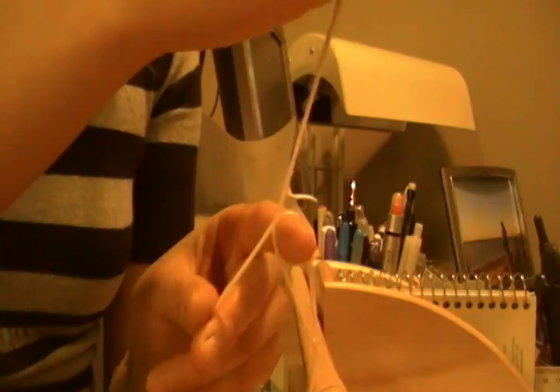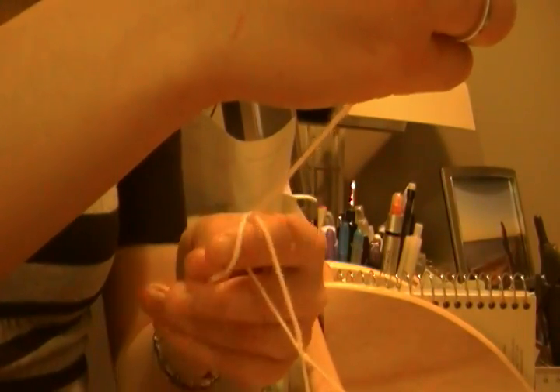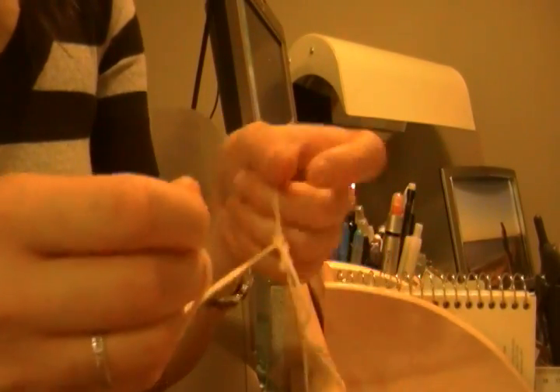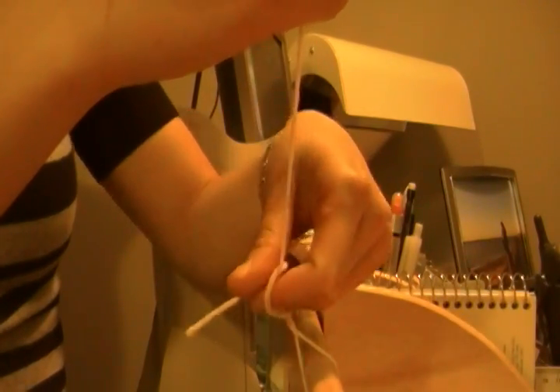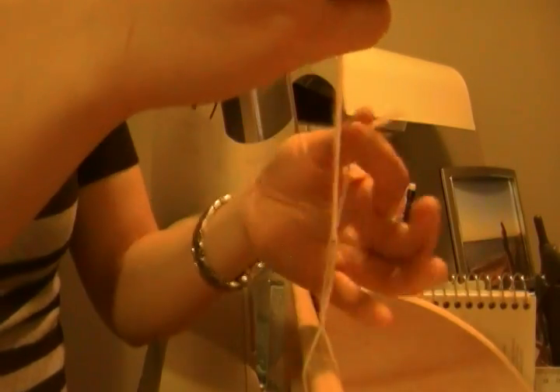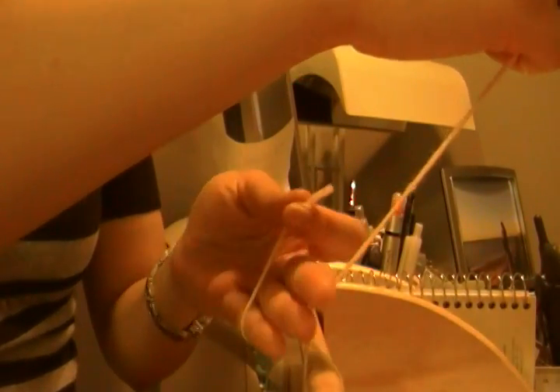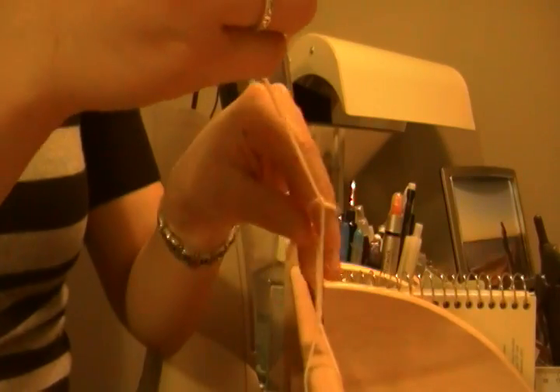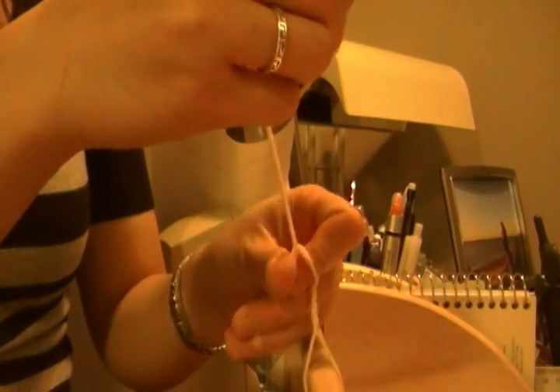Now I'm going to take this again and loop it around my index finger, around like that, and pull. Again, I end up like this in this orientation, and just loop around like that. It's a little bit short, like that.